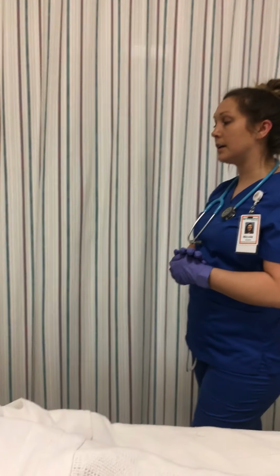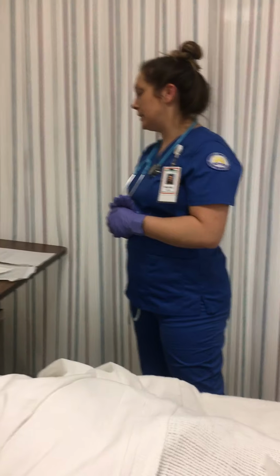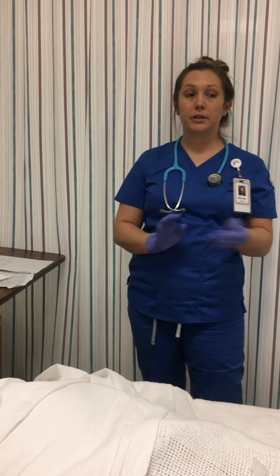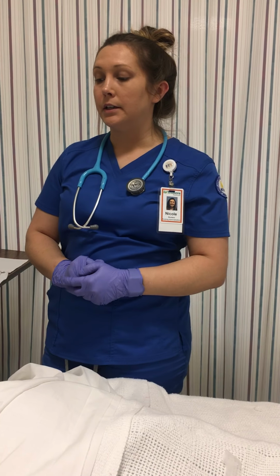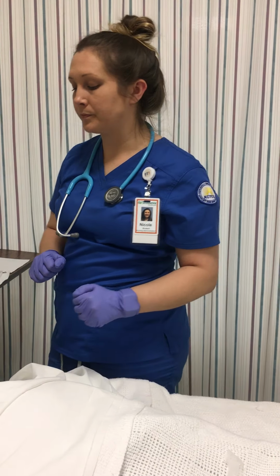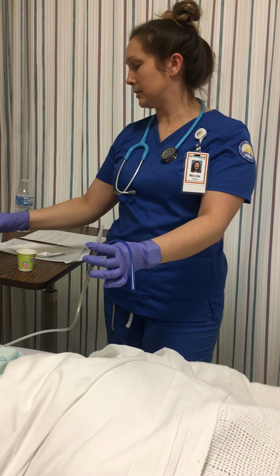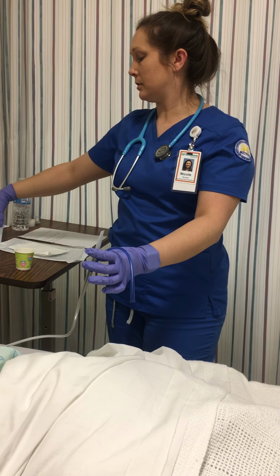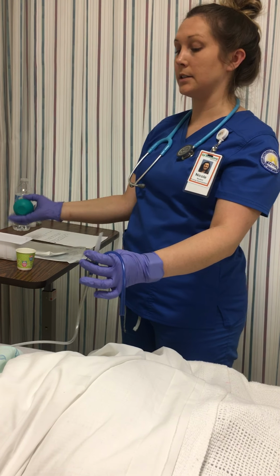And then I have an order to perform a gastric lavage. So I'm going to come in, perform hand hygiene, put new gloves on, assess patient, explain the procedure to them, disconnect from the suctioning, and then I have some 0.9 normal saline and a syringe and a container for the contents.